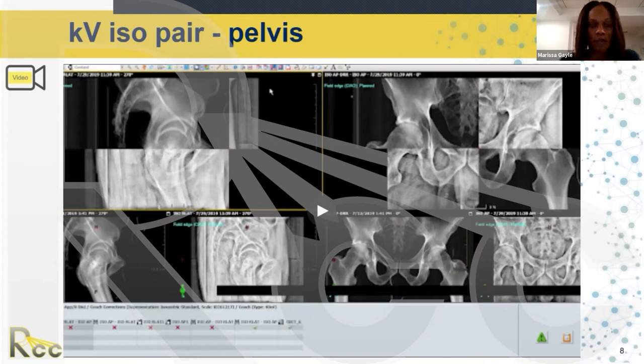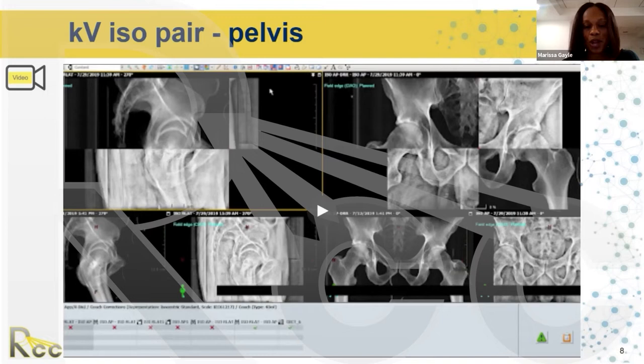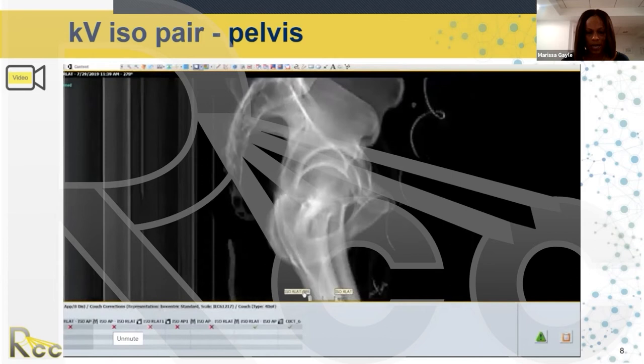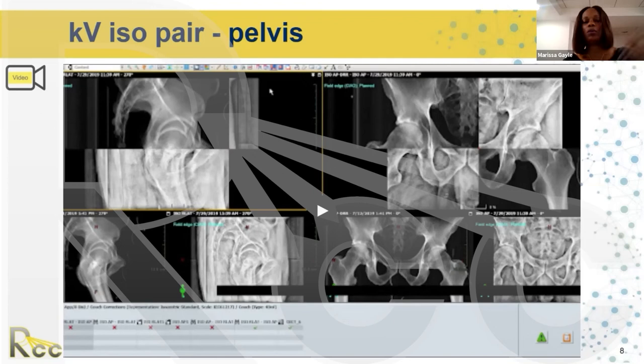Now a KV isocenter pelvis — you can see the difference between a KV and MV image. The previous Elekta example was an MV image; this is a KV image, probably on a Varian Trilogy. The KV images are noticeably sharper. I'm going to play the video once and then describe what's going on.